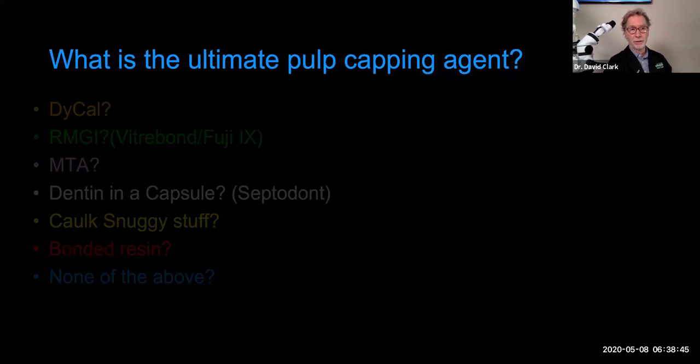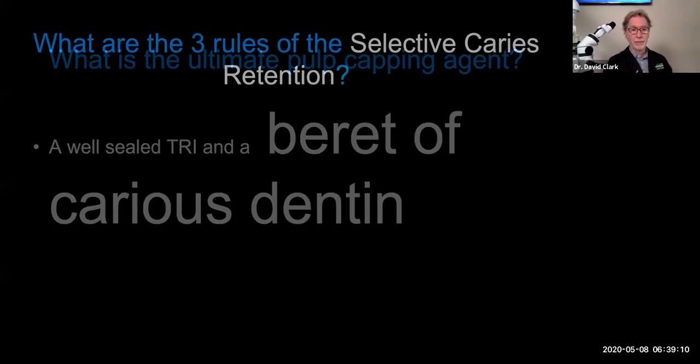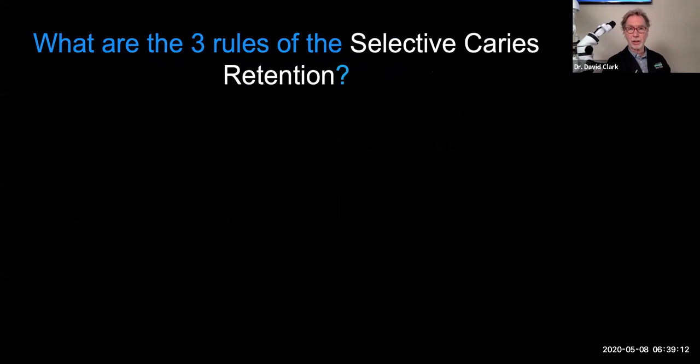None of the above. It is a well-sealed tooth restoration interface and a little beret of carious dentin over the pulp. And we are leaving frank caries. We're not leaving piles of it, but we are leaving frank caries. So the conversation about affected and infected dentin, that's an old conversation. It's over. We have a clean area of dentin that's unbelievably clean, and then frank caries. That's it, okay?